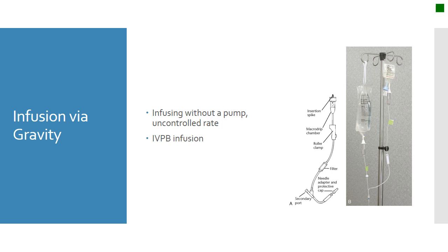That being said, when we use secondary bags of IV medication, as in what is in this picture, we want this smaller bag to infuse prior to all of this 1 liter bag of fluids. So I raise it higher. The higher the medication, the faster or the priority of the medication being infused will go. So that smaller bag of fluid will infuse first, then once it is empty, the lower bag will then start infusing. It will take over. So it is being hung by gravity.